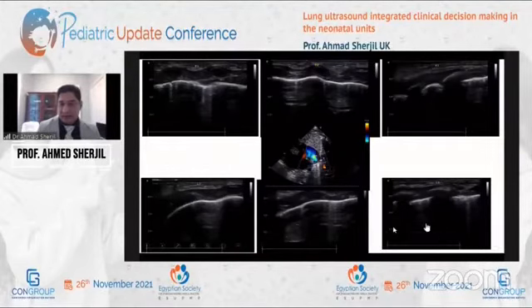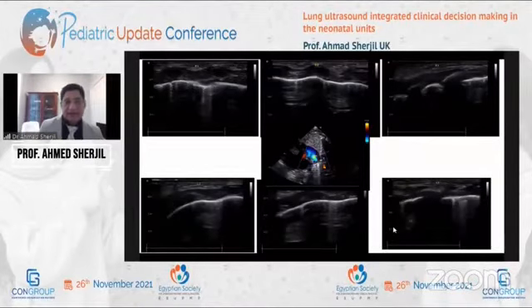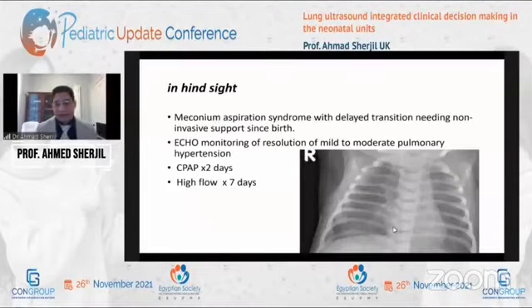And still, even without the scanning evidence, 7 days later, my colleague wanted to have an X-ray done, because he still wanted to know what's going on. So you can see it's all fine now. And then she was discharged. But I had this information 5 days ago, and that made a difference to the management, to a day when I was able to free a cot.